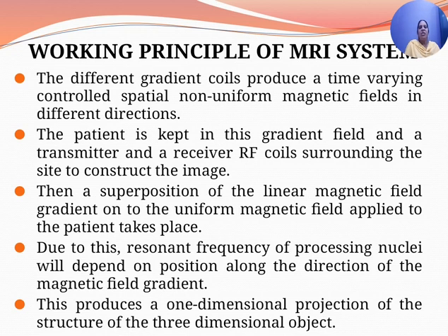This produces a one-dimensional projection of the structure of the three-dimensional object. So you get a one-dimensional image of the three-dimensional structure.